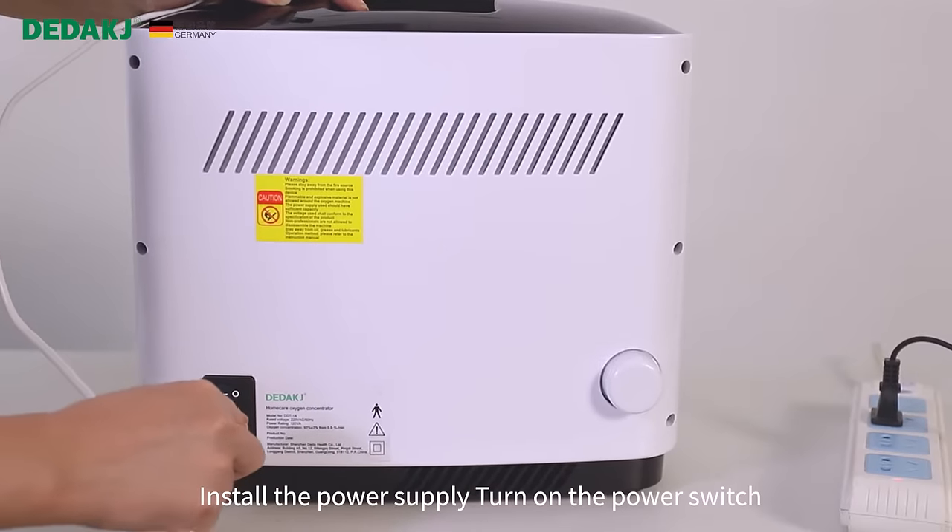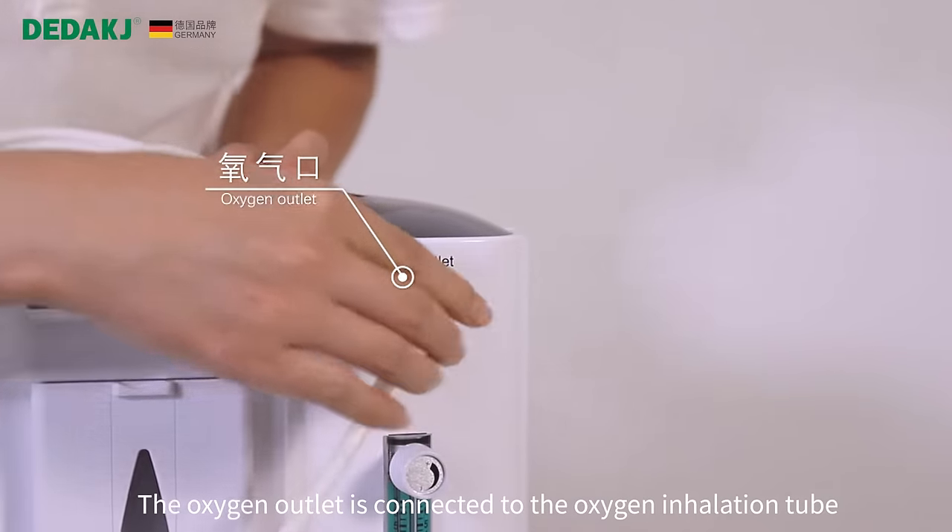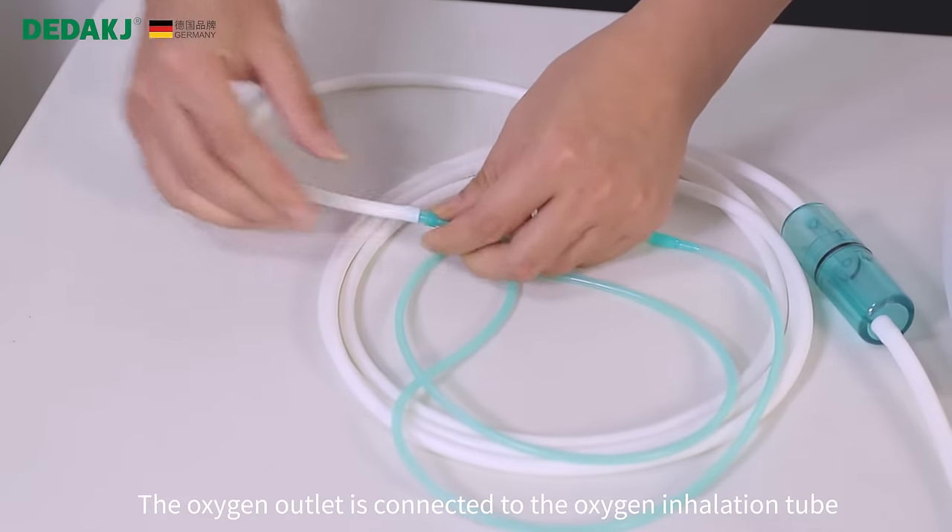Install the power supply. Turn on the power switch. The oxygen outlet is connected to the oxygen inhalation tool.